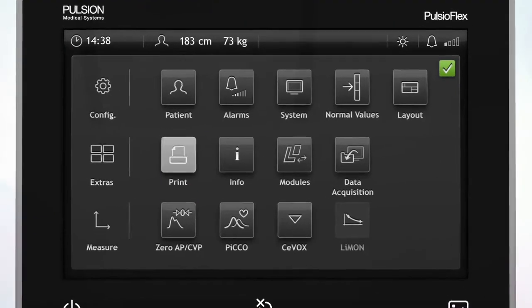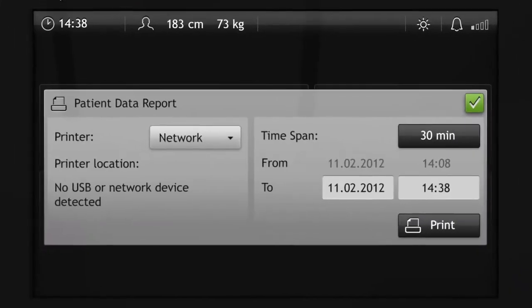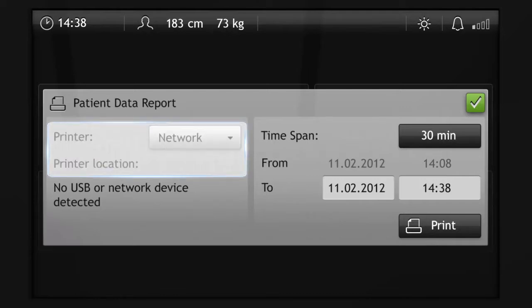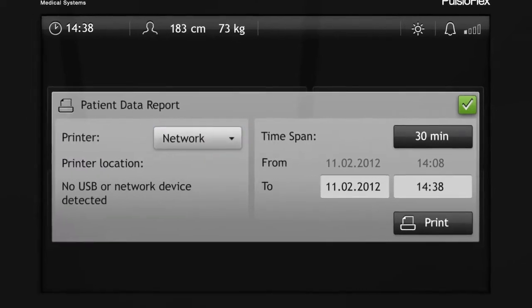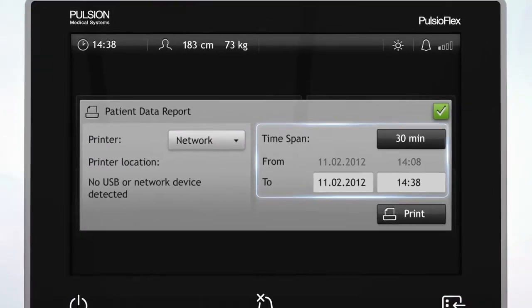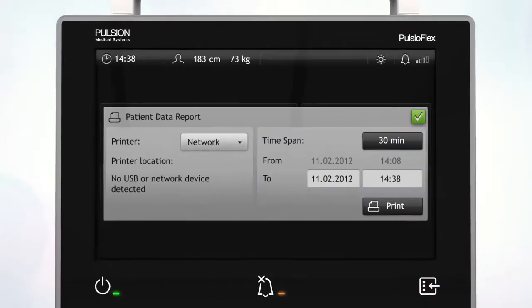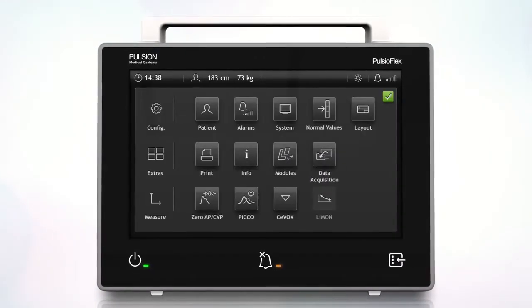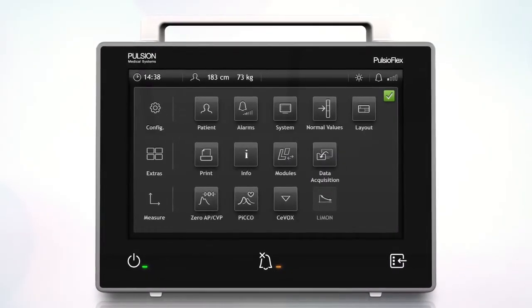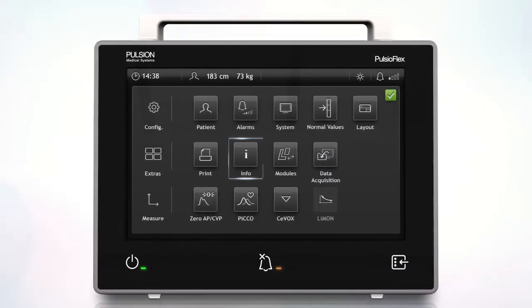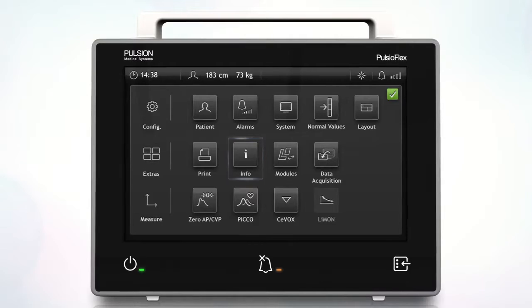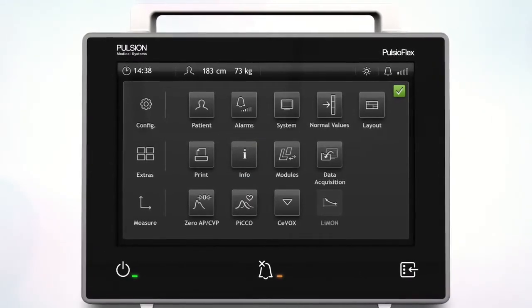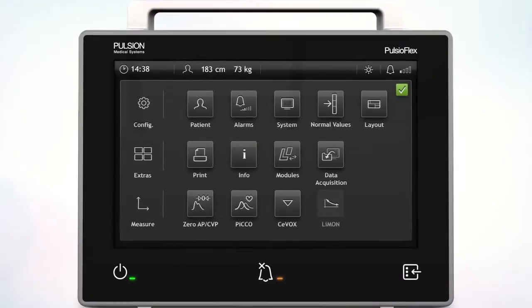To use the print function, select an output device and define the time span and the starting and end point you wish to print. In the info menu, you'll find information about the software version and the contact details of the Pulsion Medical Systems.